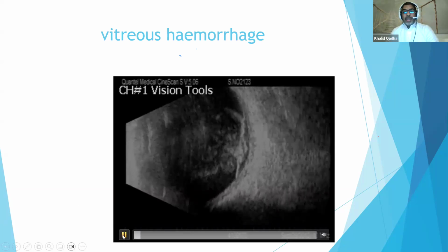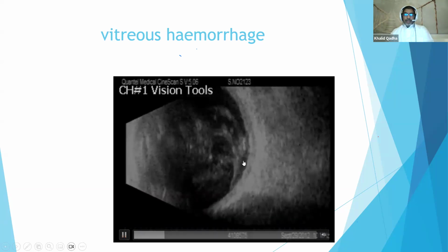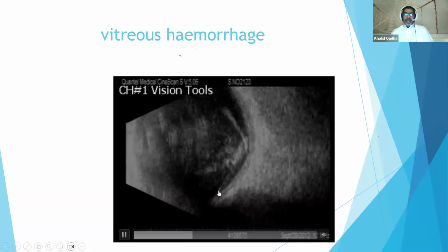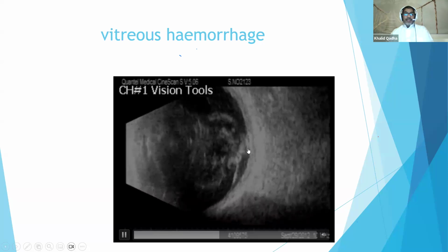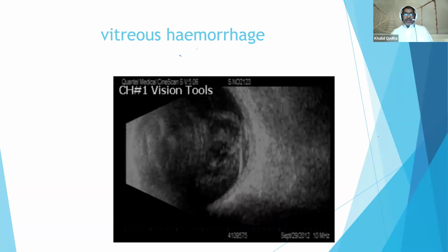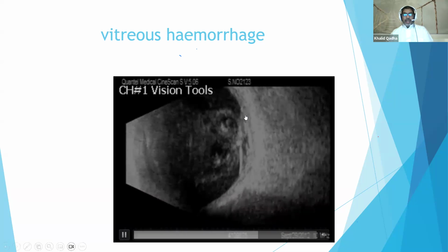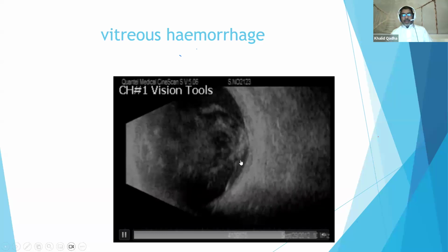It's by the movement. If you look here, you see the blood, it's sliding down with the movement of the eye, and then will go back again to the other side. If it's moving like this, that definitely it's not a retina or not a choroid. That's just vitreous hemorrhage here, and this is a collection of blood in the back as a vitreous hyphema, posterior hyphema, sorry.